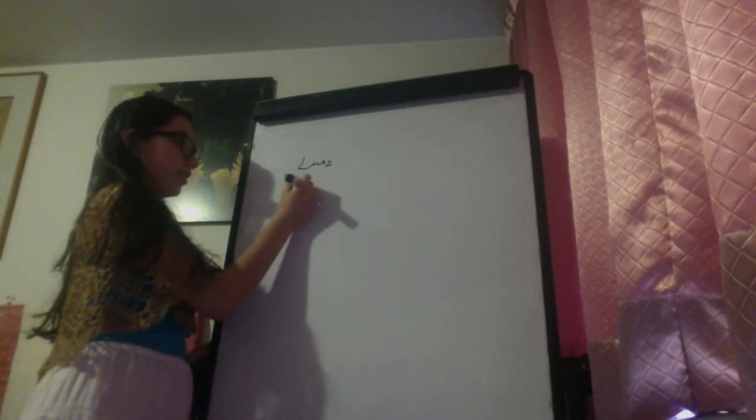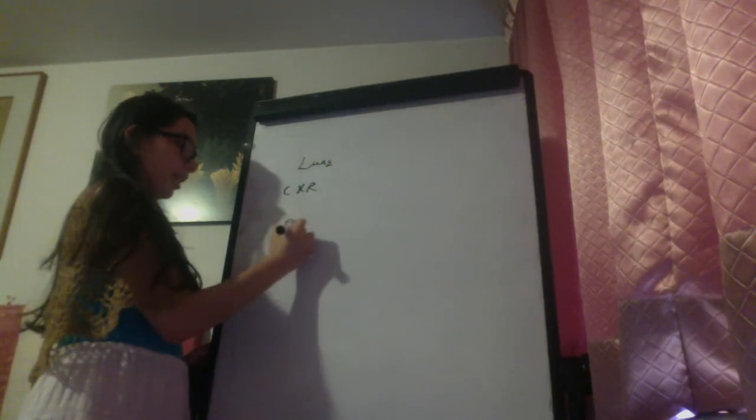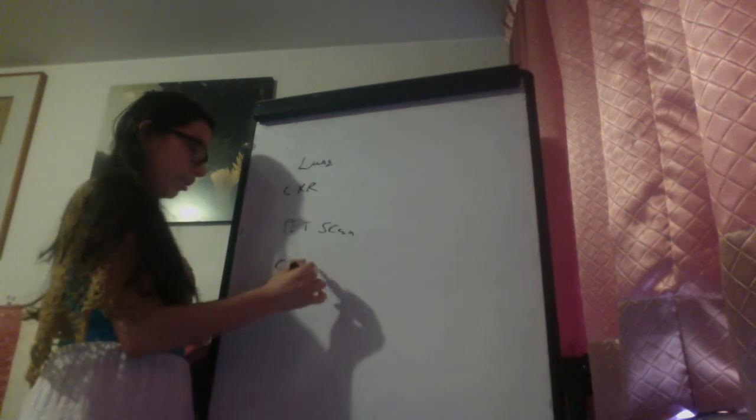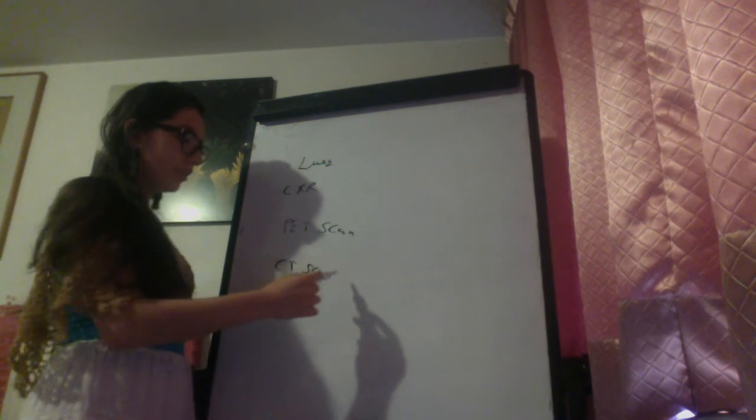We're going to see the non-invasive imaging testing for the lung. Usually we have the chest X-ray, the PET scan, and the CT scan, or computed tomography chest scan.